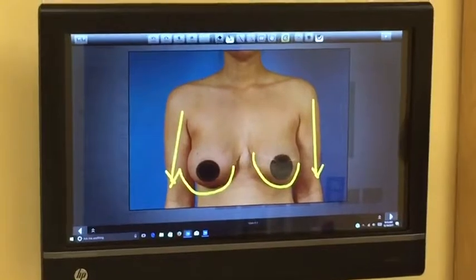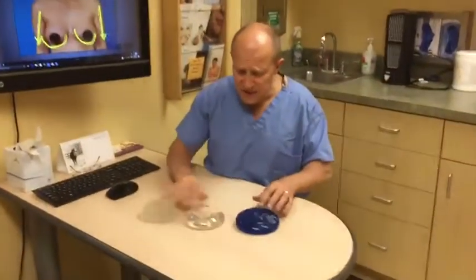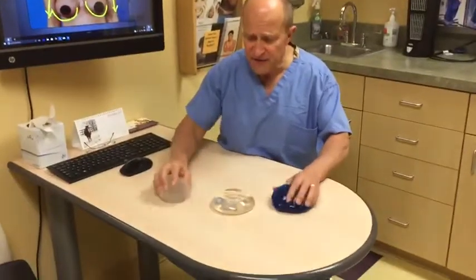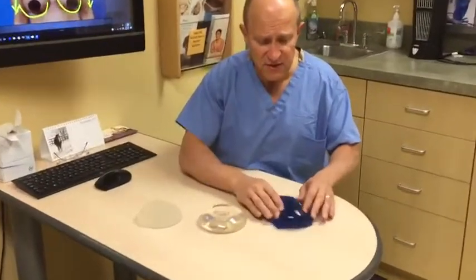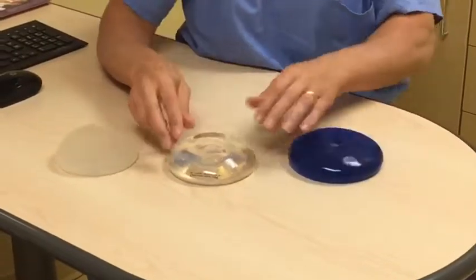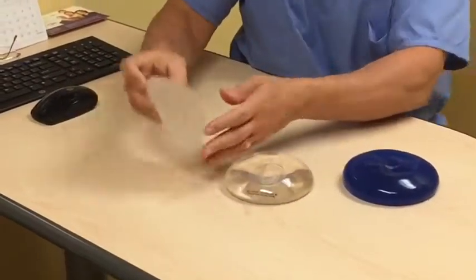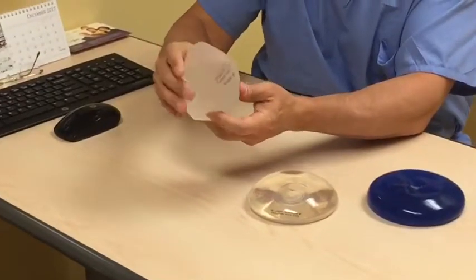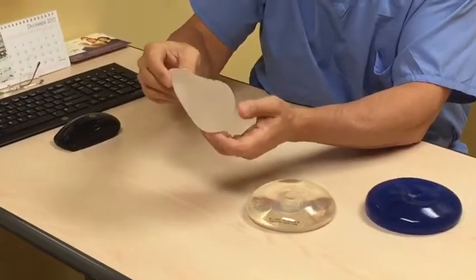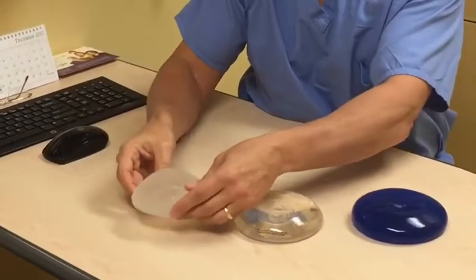And this is in large part due to the type of implant that we use. So you can see that with the implants that I have arrayed here on the table. This is a salt water filled implant. It has a little blue dye in it, so it appears blue. This is your typical round, smooth silicone gel implant. And this is an anatomically shaped implant. The gel is a little bit stiffer inside, and some people have referred to this as a gummy bear type device.